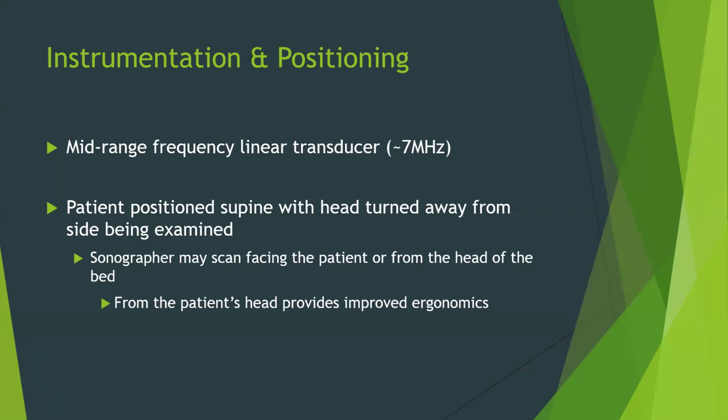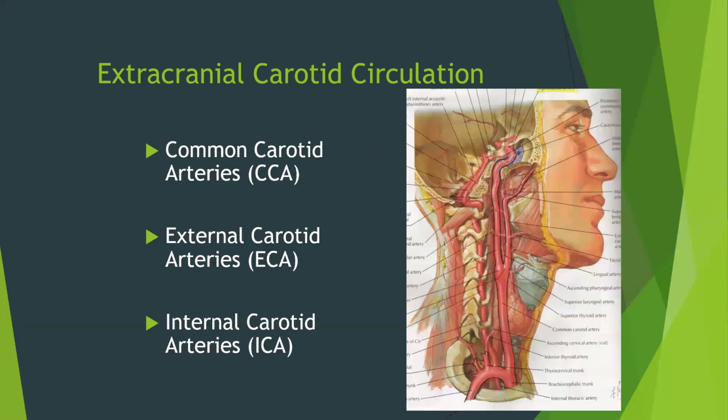It's not always feasible just because when you are scanning inpatients, you have tons of wires. You don't always have room to move the bed. But sometimes with the outpatients, this can be helpful for ergonomics. Neil talked about that a little bit, with the venous insufficiency exams, ergonomics. And so that can be an important part of making sure that you're staying healthy. So if you ever get the chance to try that maneuver, try it out.